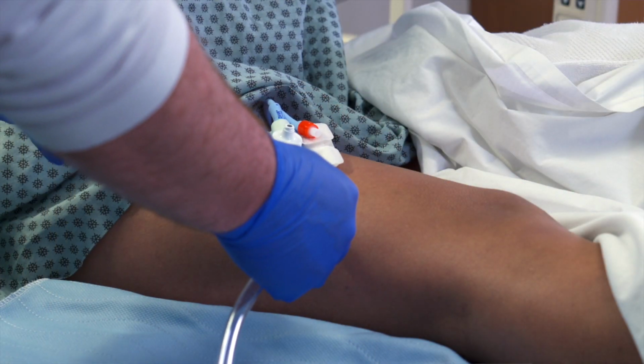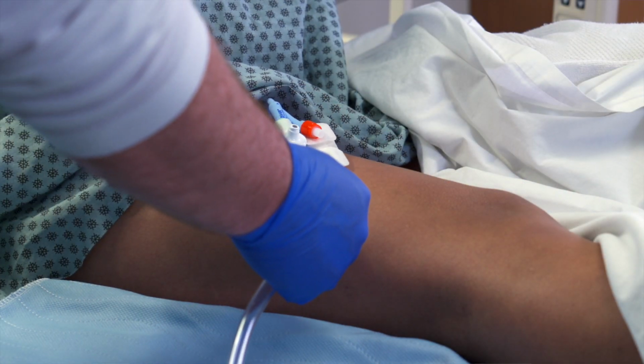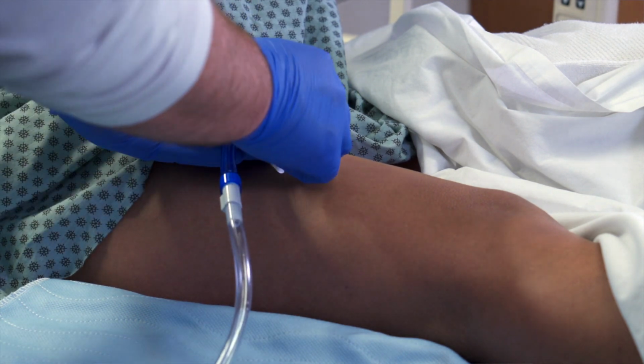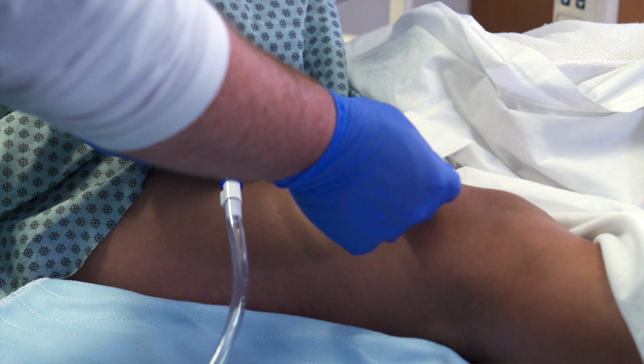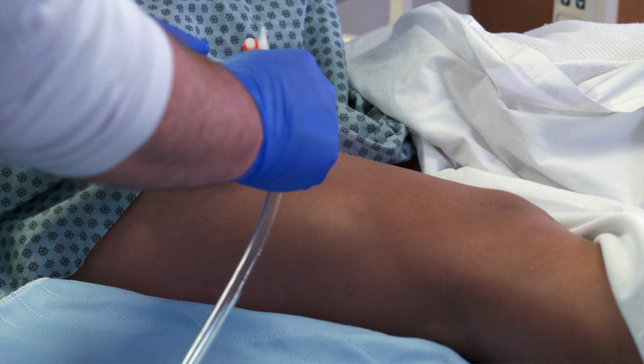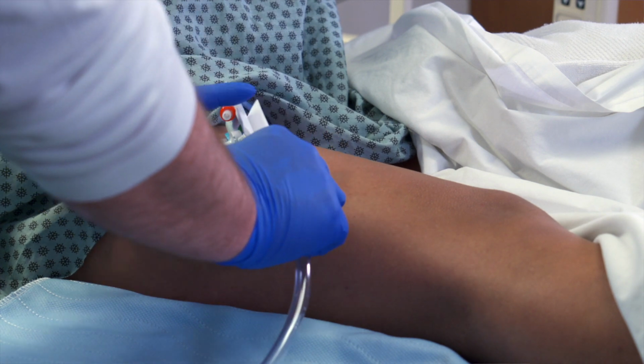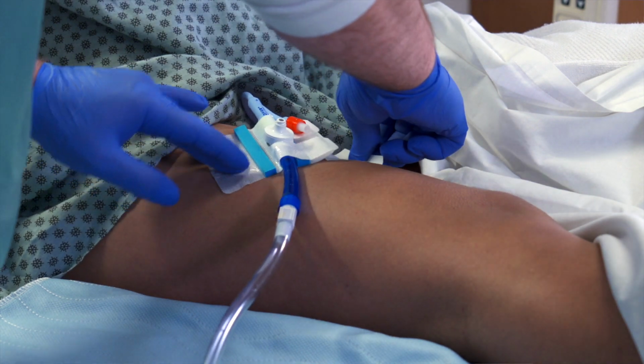Be sure that the area is clean of dirt and body oils. Ensure the skin site is dry before placement of the securement device. Remove the backing and place the adhesive side down so that the spine of the device follows a natural path from the insertion point to the intended location of the hanging collection device.